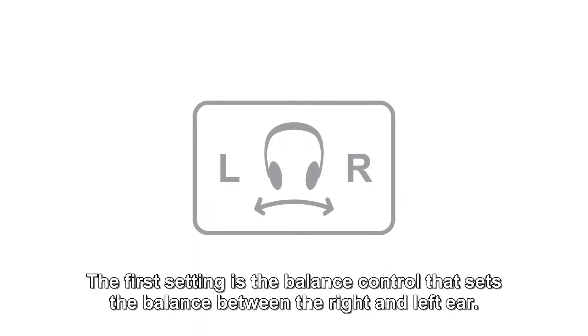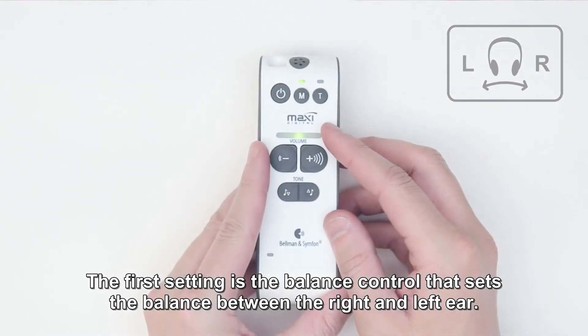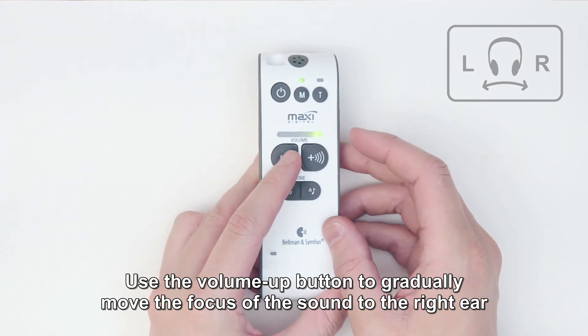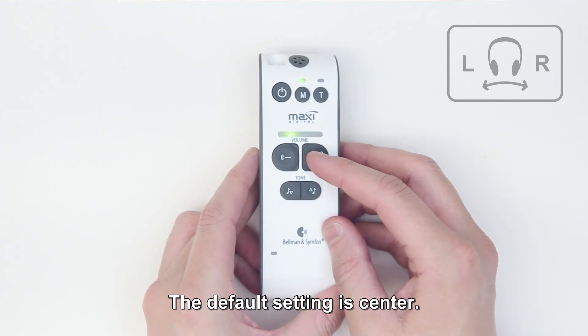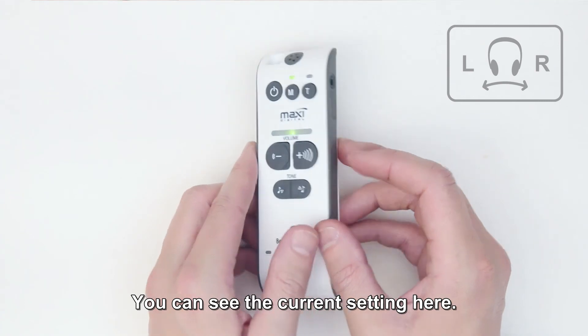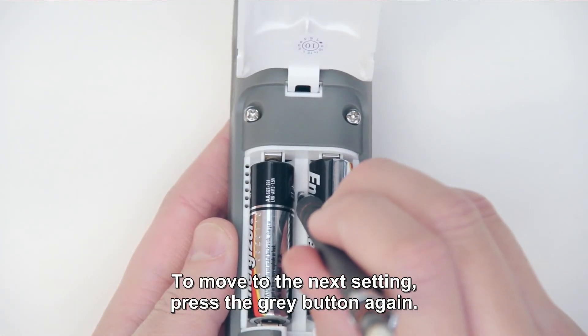Balance control. The first setting is the balance control that sets the balance between the right and left ear. Use the volume up button to gradually move the focus of the sound to the right ear, and the volume down button to move the focus of the sound to the left ear. The default setting is center — you can see the current setting here. To move to the next setting, press the grey button again.